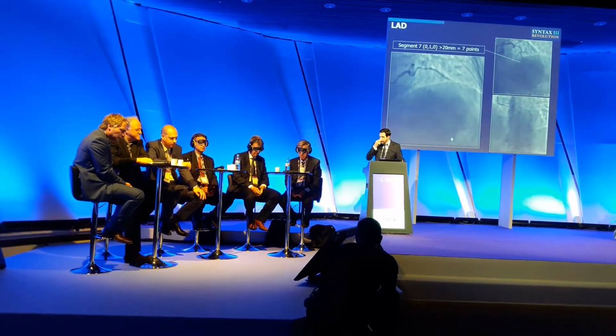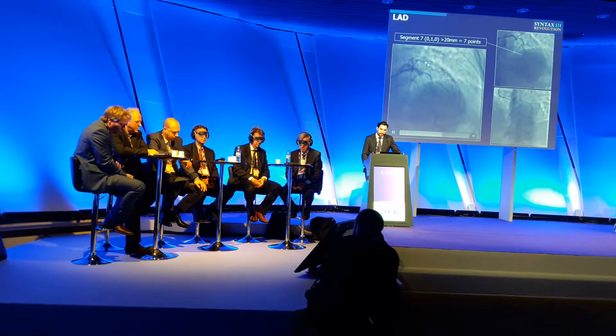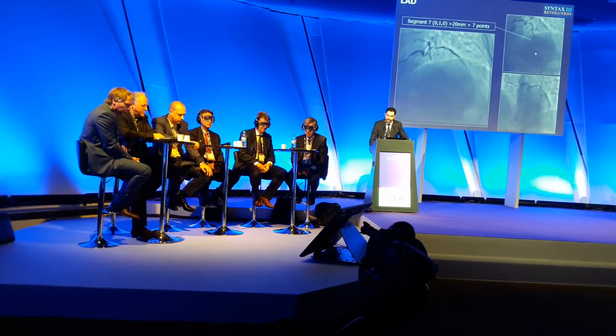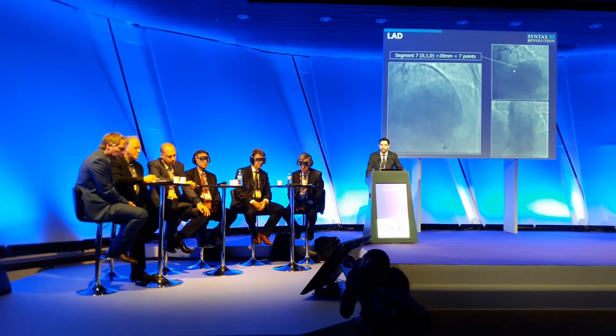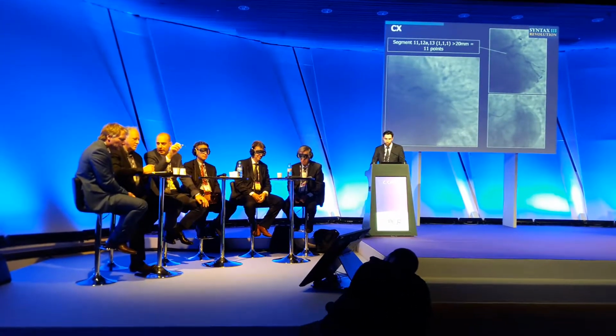Moving on to the LAD, you can see there is a long LAD. The contrast is going to the circumflex, a very short left main, but we can identify a long lesion in the mid portion of the LAD. This lesion was scored as involving the third diagonal branch, therefore it was scored as a Medina classification 010 for 7 points in the angiographic syntax score.